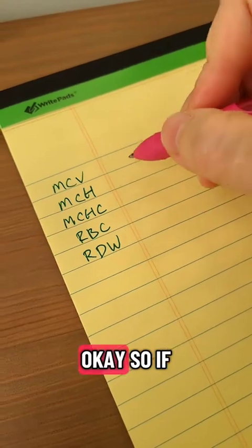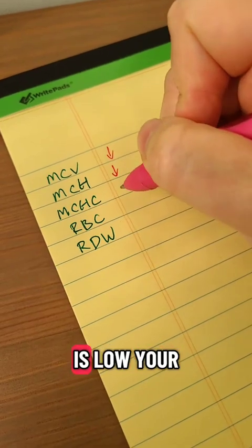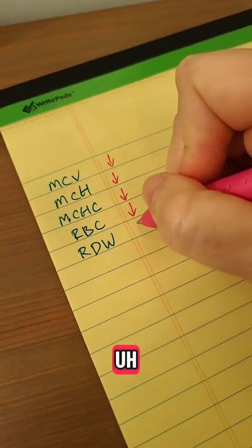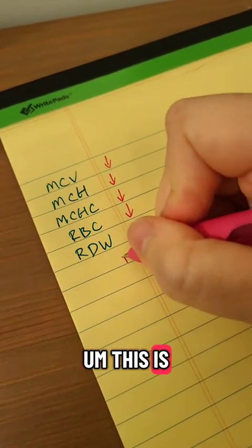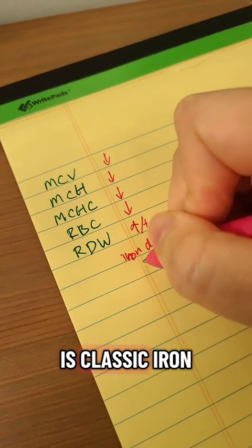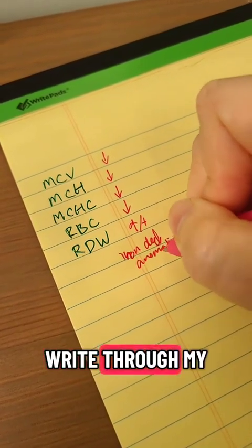I'm going to skip hemoglobin and hematocrit for right now because mostly those just tell you how severe the anemia is. Okay, so if we start with the most classic pattern, if your MCV is low, your MCH is low, your MCHC is low, your RBC is low, and your RDW might be high or normal, this is classic iron deficiency anemia. I'm going to have to do cuts in this because I can't write through my camera here.